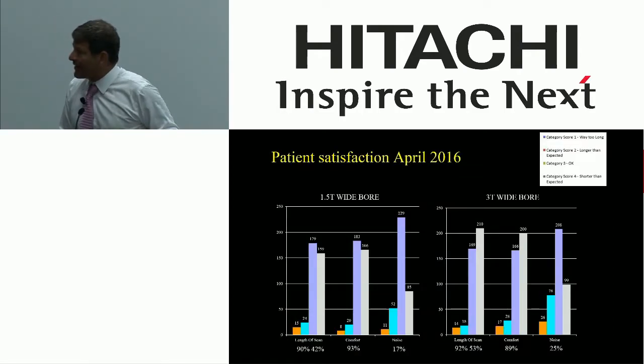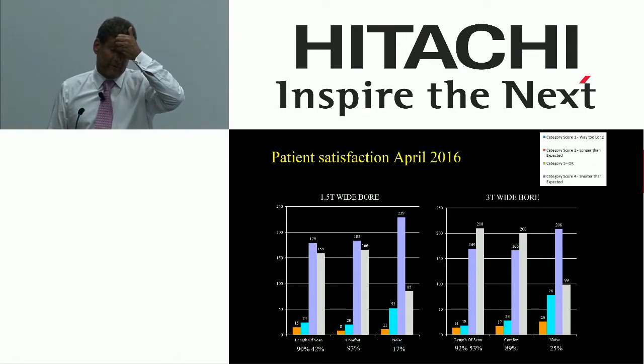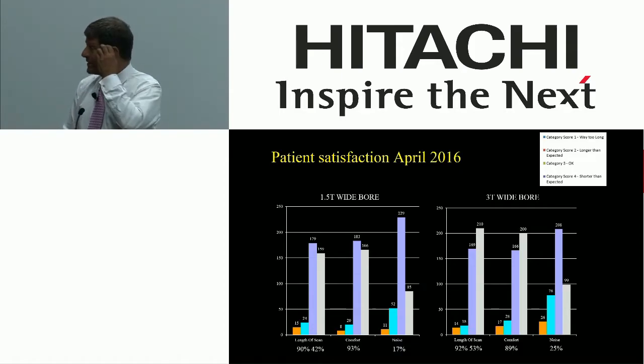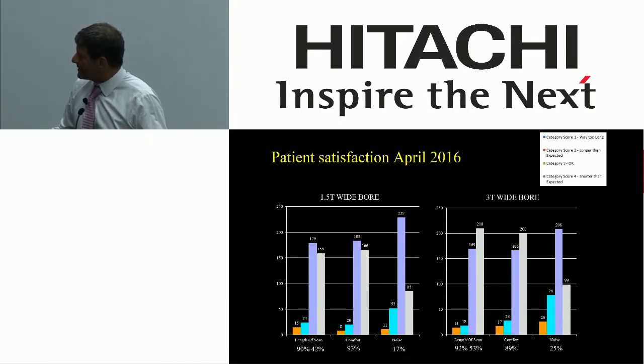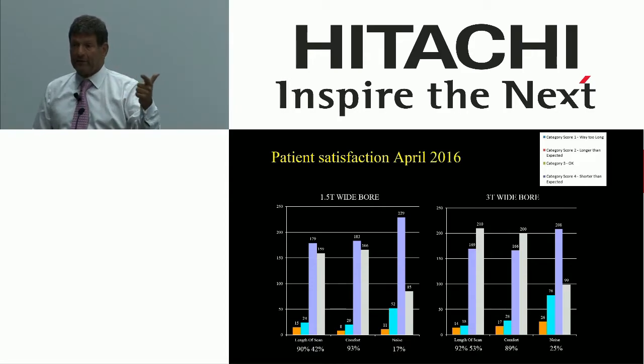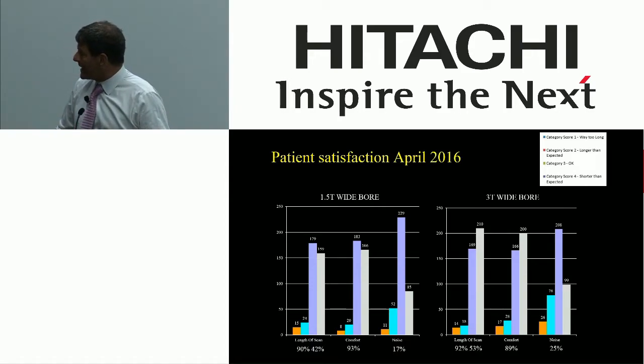Well, here's roughly 500 samples from the same facilities, same schedulers, same technologists, same neighborhood, cranky New Yorkers. Look what we get. Again, looking at the bars to the right of the blue bar. Notice that, by the way, 3T scanners are louder and they're hotter. They're not comfortable compared to a 1.5. We're getting about the same statistically significant comfort numbers.